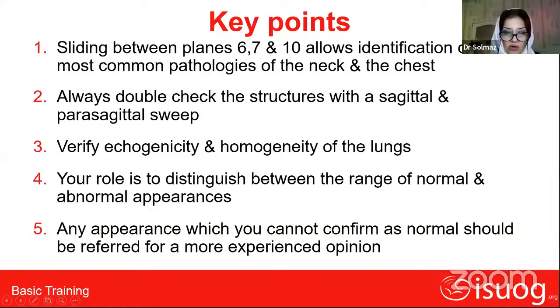Your role is to distinguish between the range of normal and abnormal appearances. So anything that raises your suspicion, please refer the patient. Any appearance which you cannot confirm as normal should be referred for a more experienced opinion.